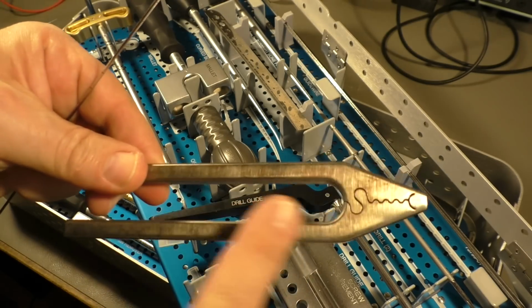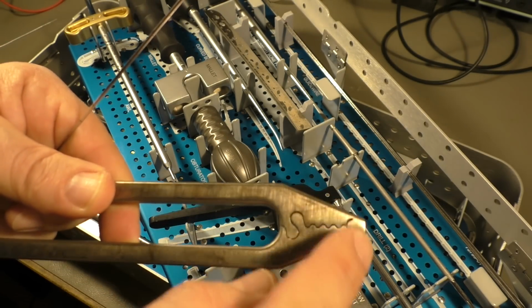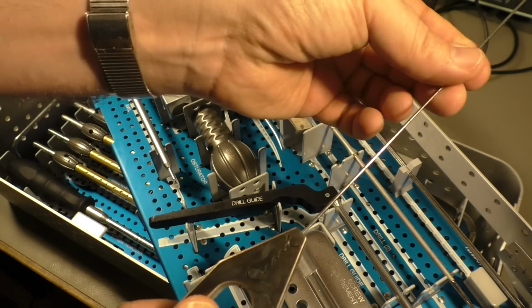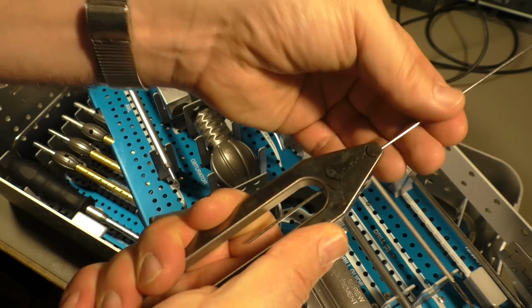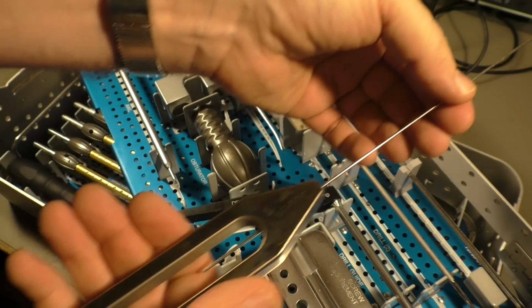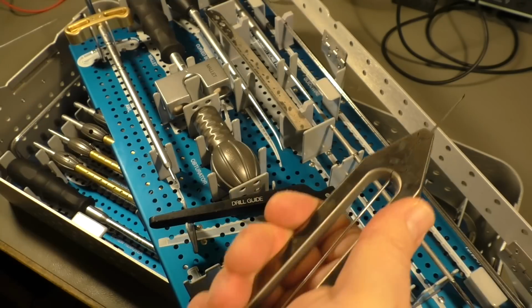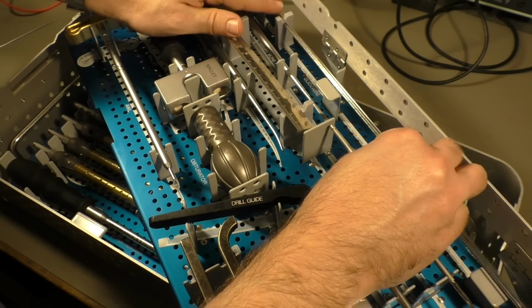Then we have this weird looking thing. It's a solid piece of steel with some laser cut lines here that make it possible to bend it a little bit. And that's exactly to hold this kind of wire. Now when I press it, it's tight. When I let go, it slides up and down. So you can pull a wire with that. Okay, fascinating.